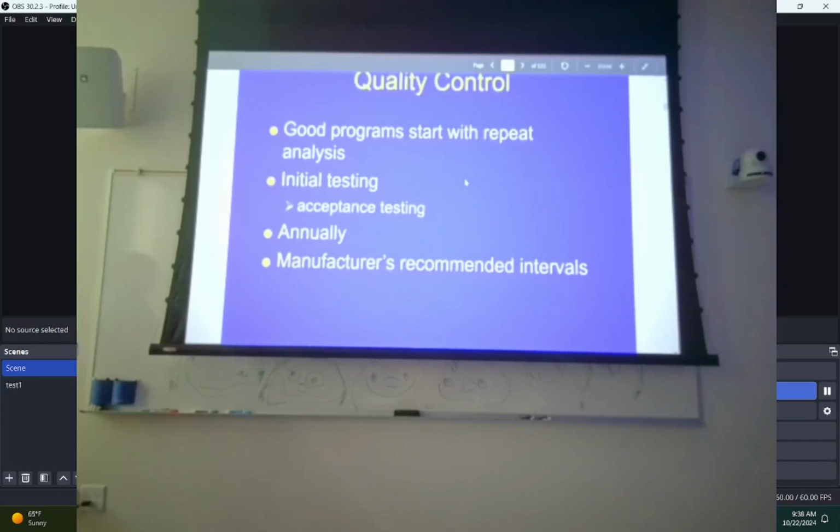It should go into some sort of repeat folder so that they can assess what's going on with individual exams while the exam was repeated. But where's it going most of the time? It's actually say delete, and part of that in a lot of cases is the tech just doesn't want to hear about it.